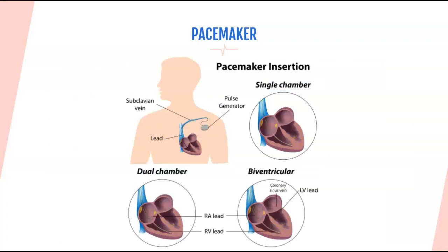The previous slide talked about an external pacemaker, and now we will talk about an internal pacemaker. So an internal pacemaker is a battery-operated generator that initiates and controls the heart rate by delivering electrical impulses to the heart muscle via an electrode. There's also the temporary transvenous system that can be inserted in an emergency after they've been transcutaneously paced. And this is when an external battery generator is connected to wires, and that's threaded to the right ventricle through the subclavian or femoral vein, and the battery pack is outside of the skin.